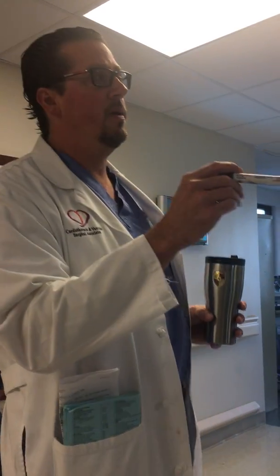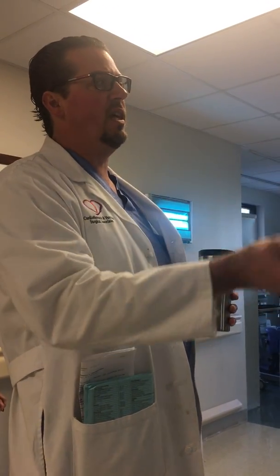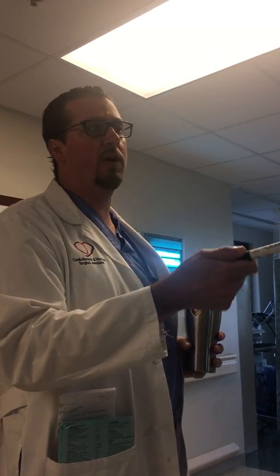The other thing with a balloon pump is you've got to be sure that it's in the right spot. Because if it's too low, I've seen people kill kidneys and livers, because you're literally occluding blood flow to the kidneys and the livers. The other thing is always be sure we've got a pulse in the foot. You guys always do that. Always be sure there's a pulse distal.